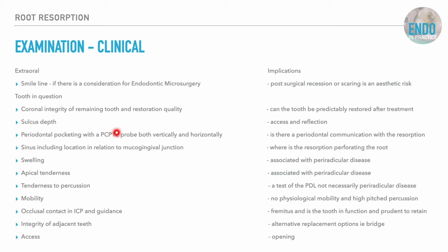You need something like a PCP12 probe to investigate these teeth. And the sinus in relation to the location of the mucogingival junction is very, very telling. So assessing where that sinus is correctly is very important.